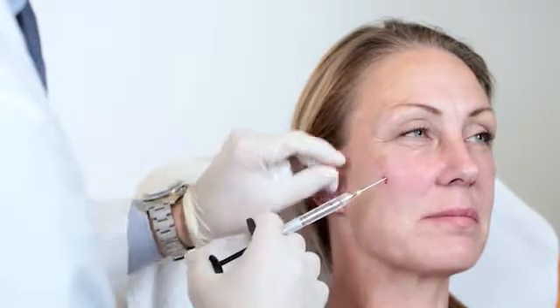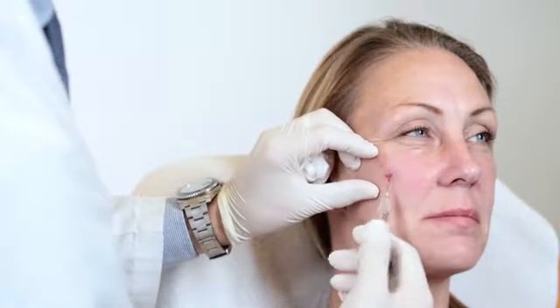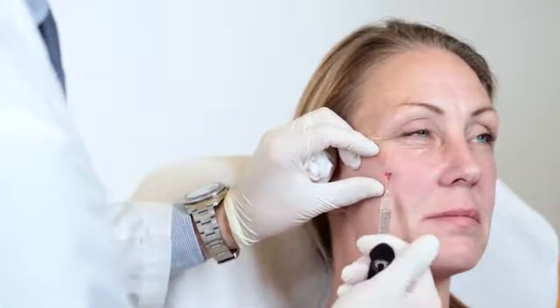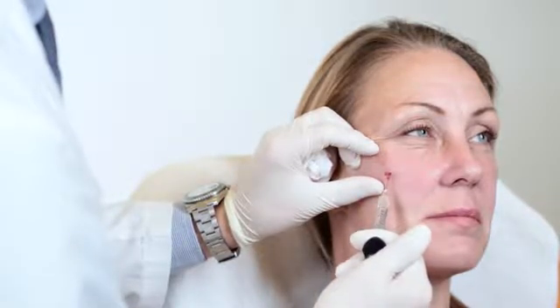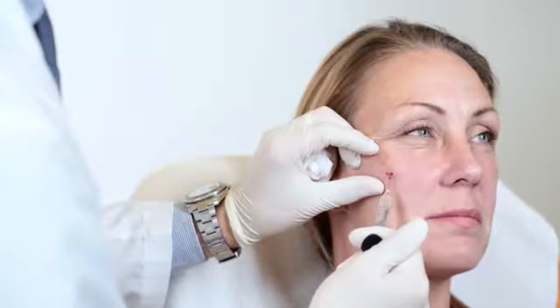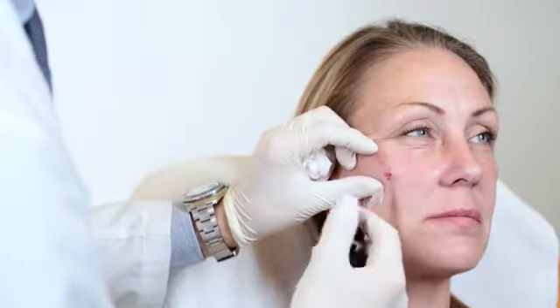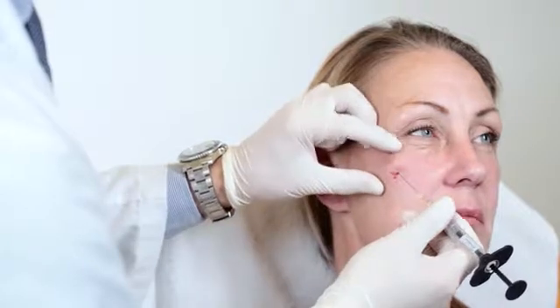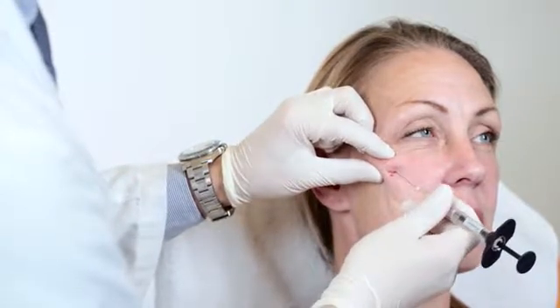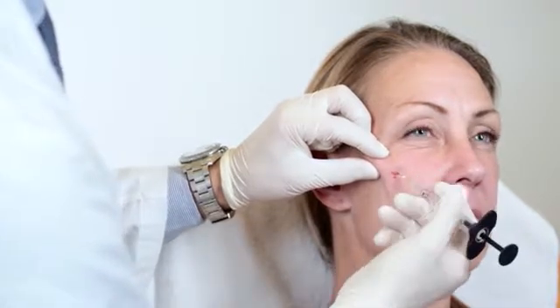Once I've filled this space sufficiently, I turn around the cannula and I place a bolus on the zygoma to create an apex for Ami's cheek. I then finish by backing off, changing direction into the pre-zygomatic space. I lift the malar fat pad to facilitate maneuvering my cannula into this area, and as soon as I feel no resistance, I know that I'm supraperiosteal.